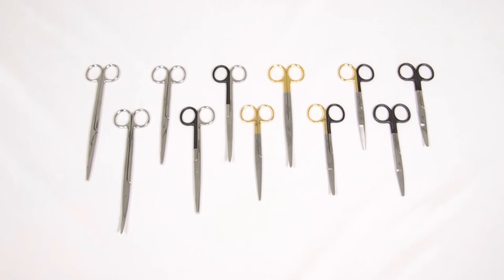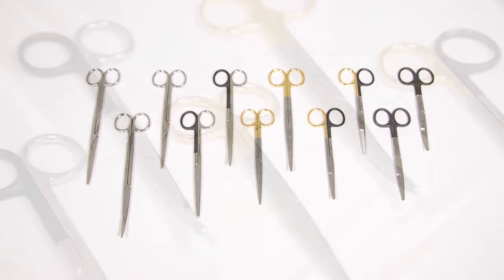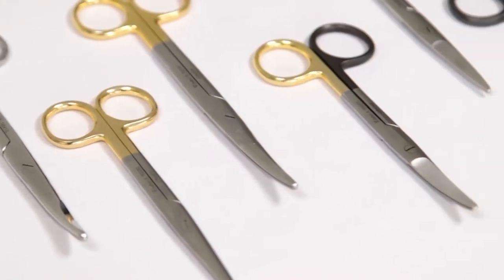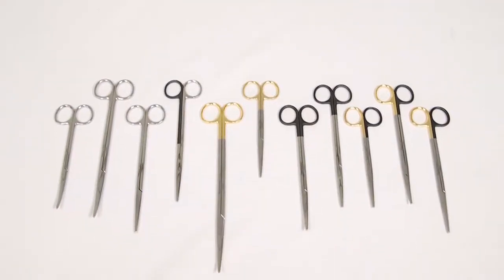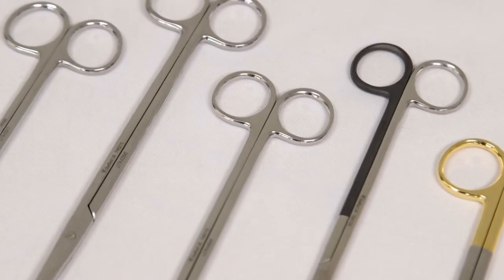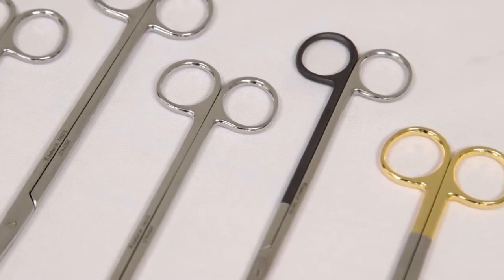Mayos are excellent general-purpose surgical scissors typically used for soft tissue dissection, where the tissue is denser or thicker. Metzenbaum surgical scissors are designed for finer, more delicate soft tissue dissection.